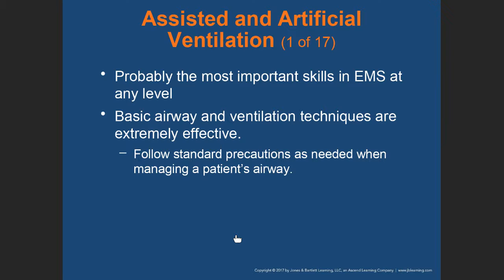Now let's differentiate the two. Assisted ventilation is when you have a patient with a decreased level of consciousness with poor chest rise, and you have to breathe for that patient.